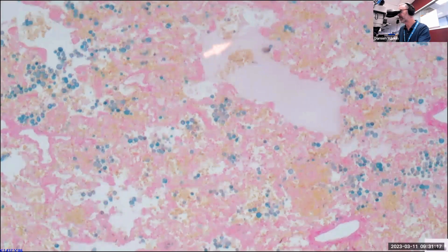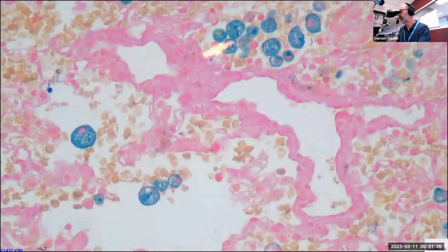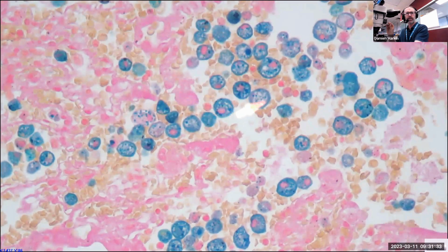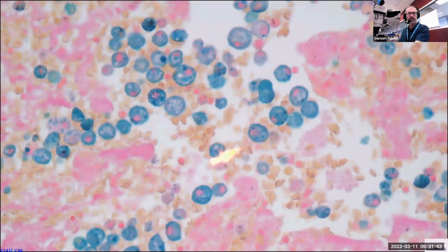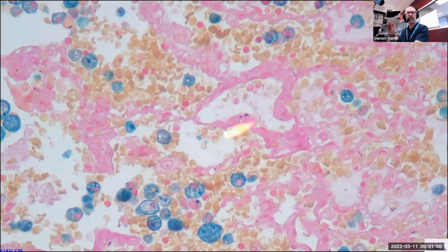is a very hemorrhagic bit of lung tissue, and I'll just let you take that in for a moment. Look at the colors there. It's beautiful, isn't it? So we've got these round looking cells clustered here. We've got some smaller cells. You don't actually see much in the way of normal lung. I might see a little bit of an alveolus there, for example. May have potentially a bit of carbon or something in there.